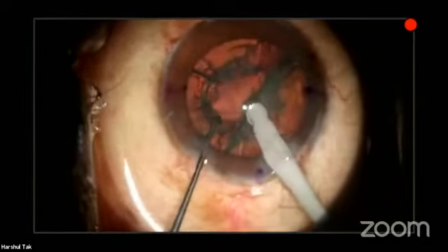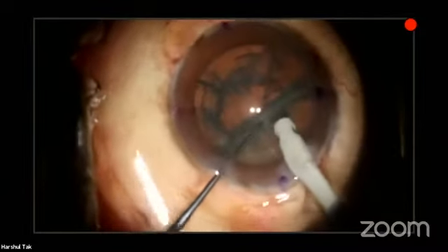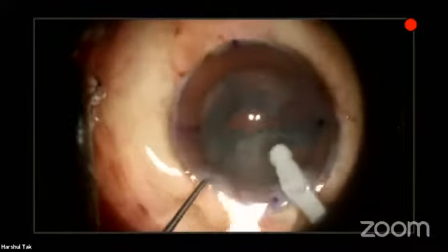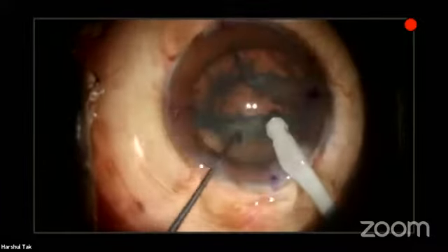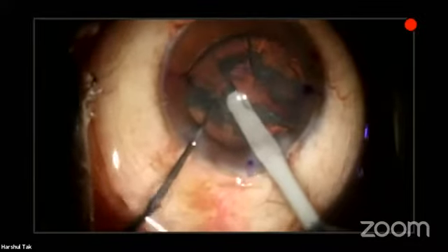Always try to keep the phaco probe in center. Let all the pieces come into your phaco probe. This is the other half which I am rotating.